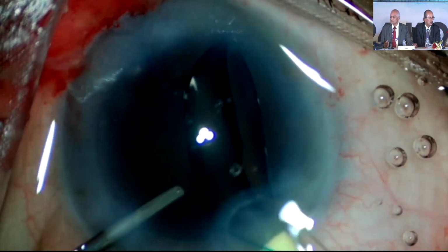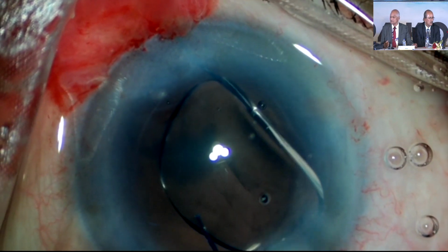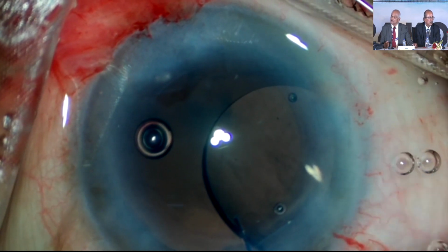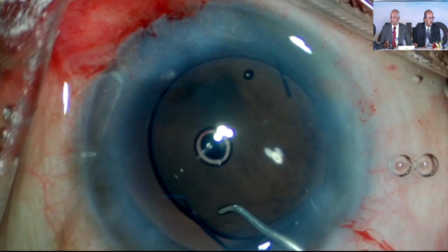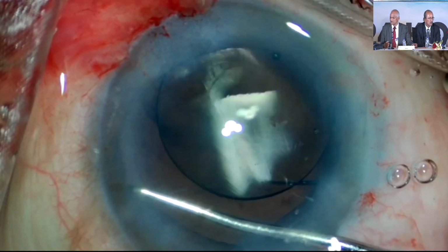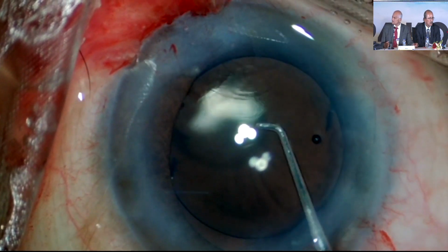So you can do vitrectomy and then implant the IOL. Which will I implant, 1 piece or 3 piece? Foldable 3-piece. It is always better to implant a foldable 3-piece, and you can have an optic capture also if you can do it. Okay. Thank you.